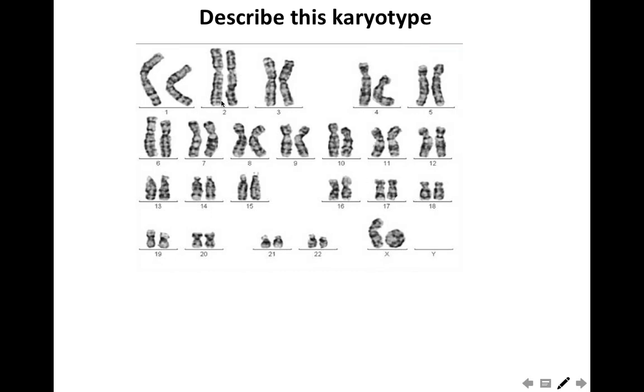Let's describe this karyotype. The number of chromosomes is two pairs of each chromosome, so it is 46, and comma, this is the sex chromosome is one normal X and the other X chromosome is looking like having the shape of a ring, and this is described as 46XX ring X, and sometimes we just write one X and the second X as an R X.